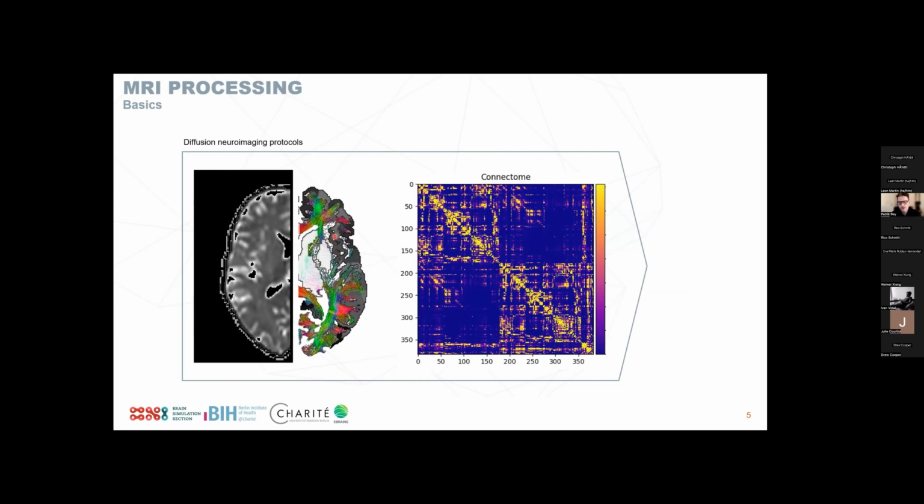So we get two structural connectomes that we want to use in TVB, one being the actual strength of the connection and the other one being the delay, basically. If we think about one brain region being active, the impact of that activity on another brain region will, of course, be delayed depending on how far away these regions are from each other. So we take this information from the diffusion imaging and integrate this into TVB.